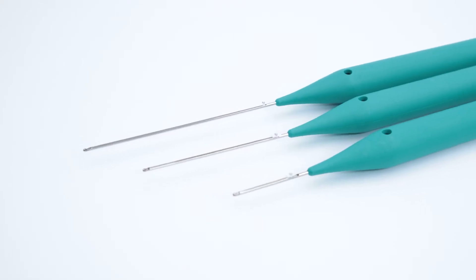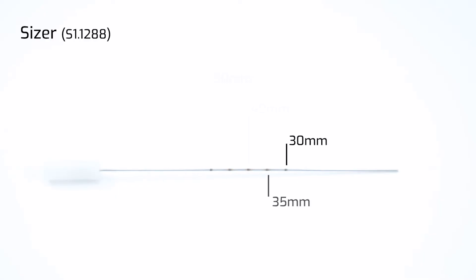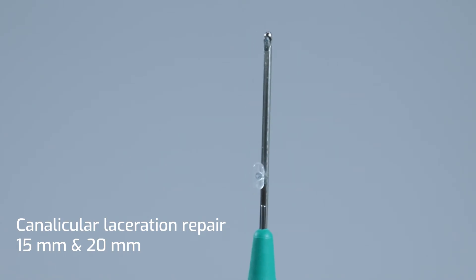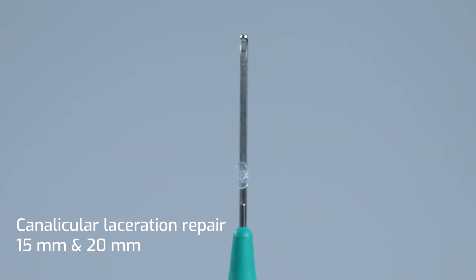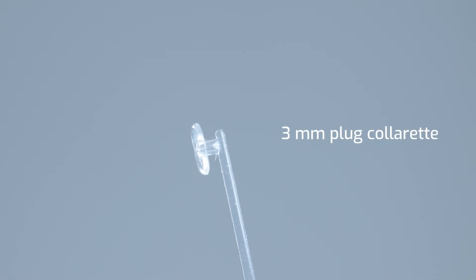The LacryJet is available in 7 lengths. The two smaller sizes, 15mm and 20mm, have been specifically designed for canalicular laceration repair to prevent future canalicular obstruction due to scar tissue formation. The 3mm plug collurette assures the stability of the intubation.